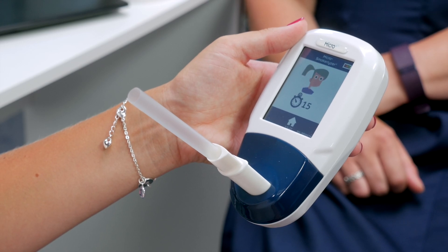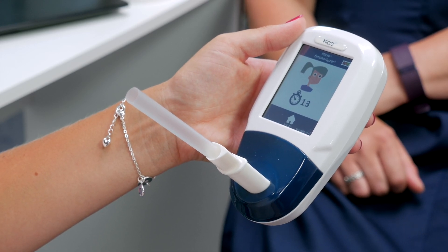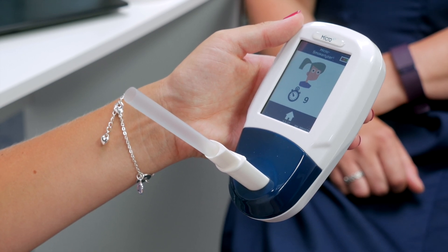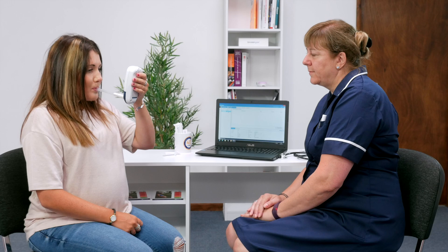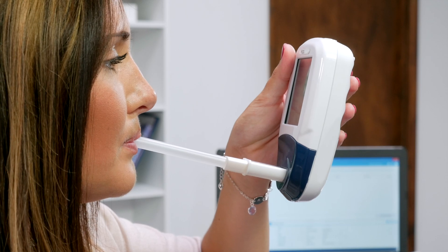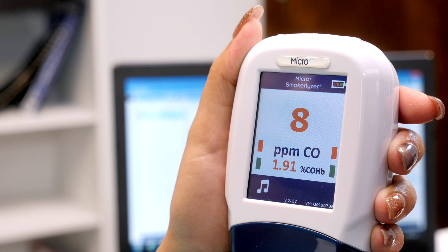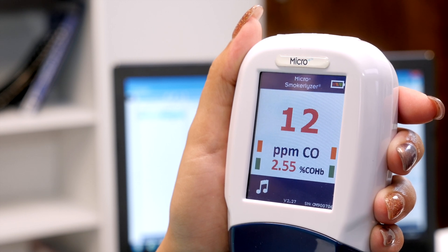The Micro Smokerlyzer does not need regular calibration. However, if it did not successfully pass the bump test, the sensor may have drifted out of specification. This can happen due to a number of things, such as using products containing alcohol on the monitor, and you may need to perform a calibration to rectify this.